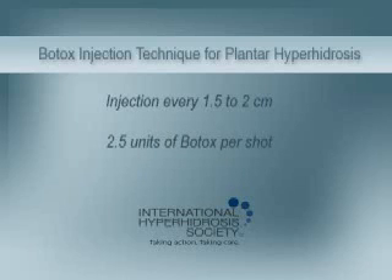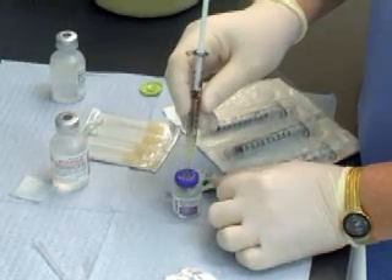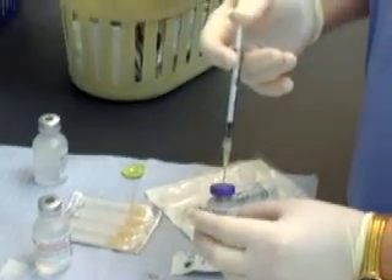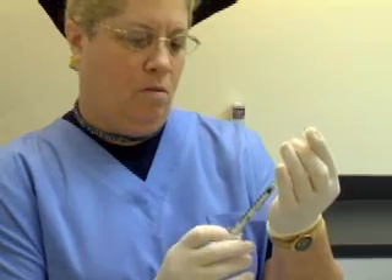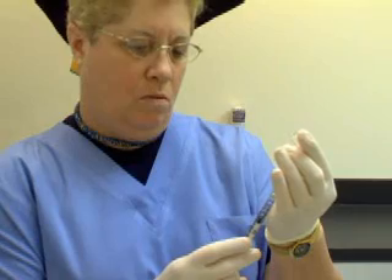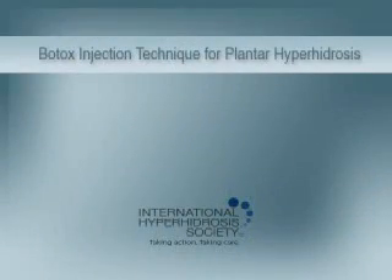Each shot will be about 2.5 units of Botox, with 100 to 200 units being used per foot. Reconstitute 100 units of Botox brand botulinum toxin type A with 4 cc's of sterile saline. Draw the Botox into 1 cc syringes with a lure lock. Use a 30 gauge needle on each syringe.